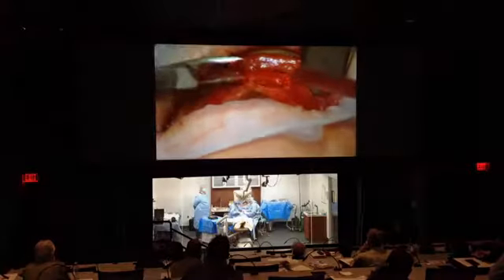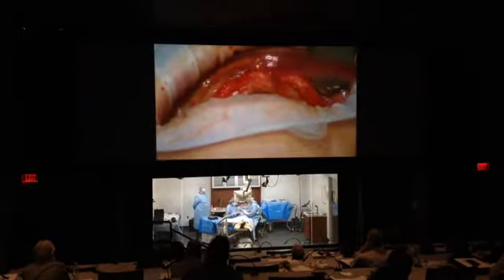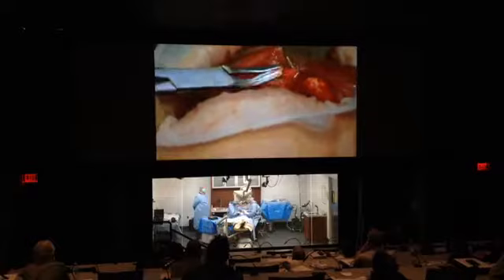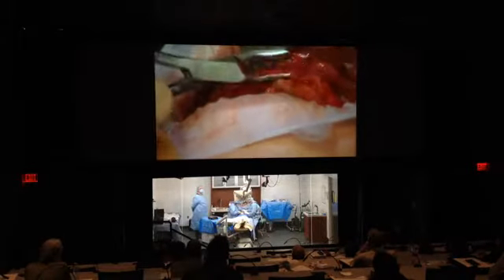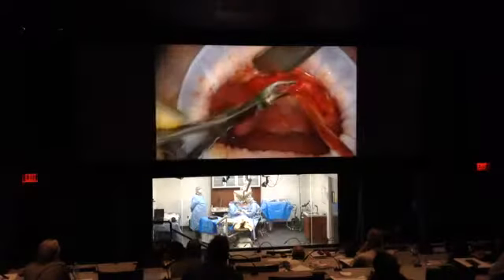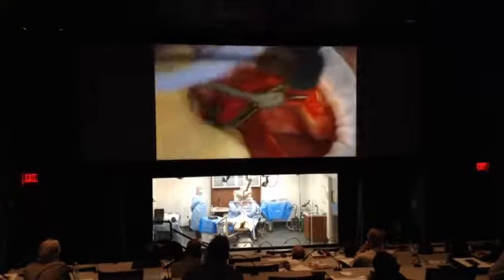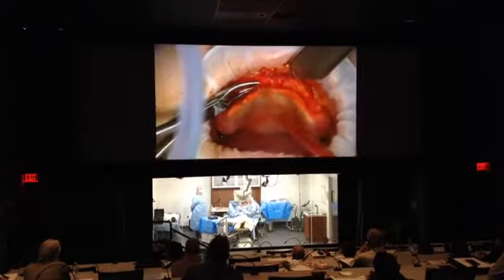You're doing great, my dear. See right here in the front is a point that I also don't like. We'll just remove that. There's some soft tissue there. If you have any questions, you're welcome to ask while I'm doing this. I'd be happy to answer them, before, or during or after. Okay.